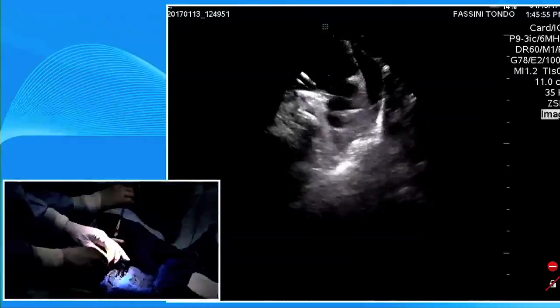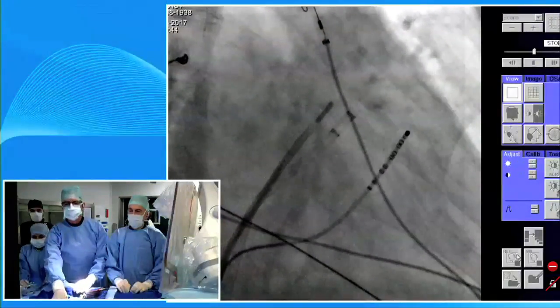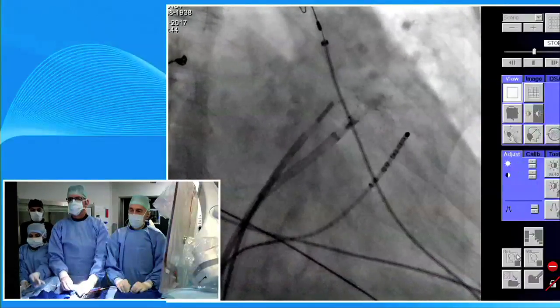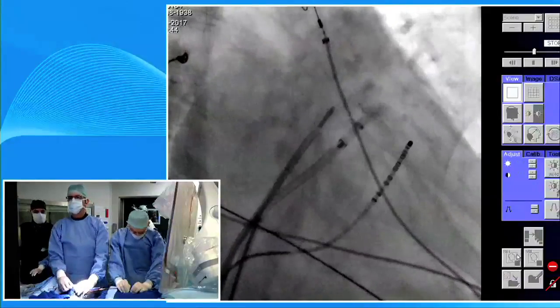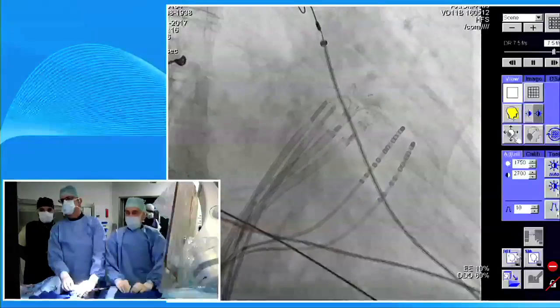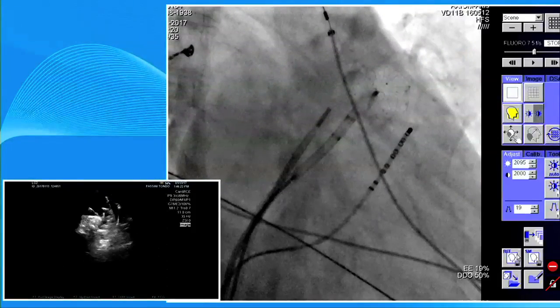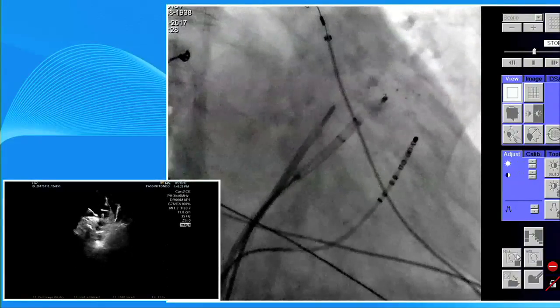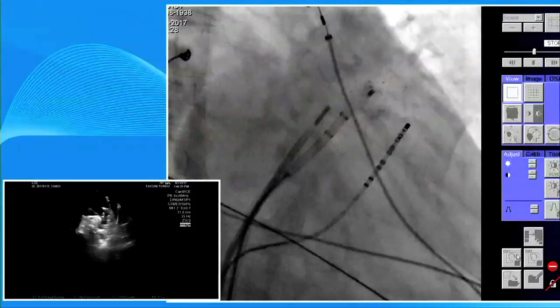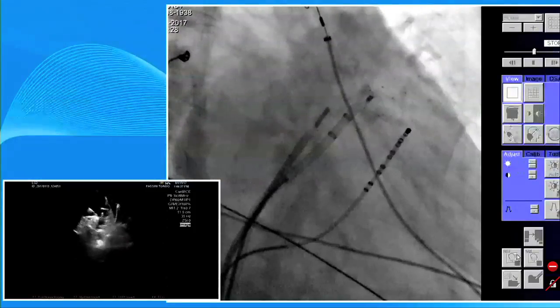This is a completely retractable and recapturable device due to the U-shaped hooks I showed you before. I'm holding the sheath while Gaetano advances into one of the lobes. Gaetano is maneuvering the ICE to show the location of the lobe inside. I think we are ready to open up the disc - I pull the sheath back while Gaetano is holding.